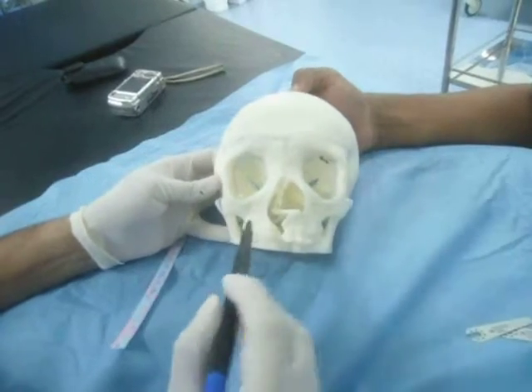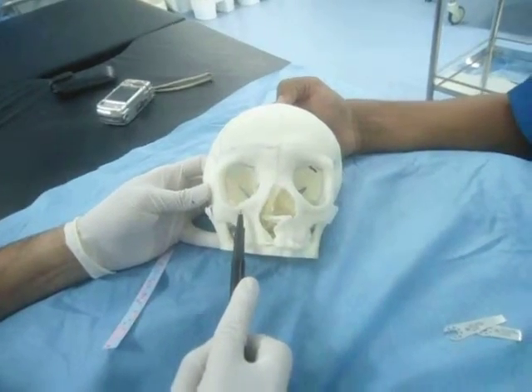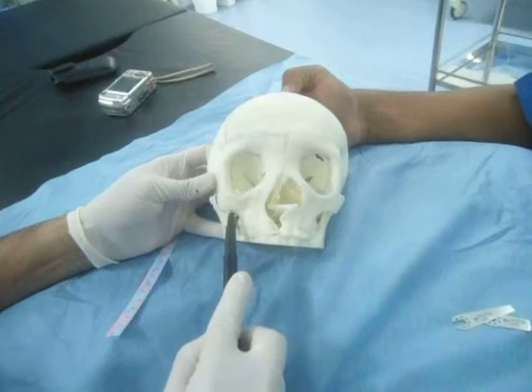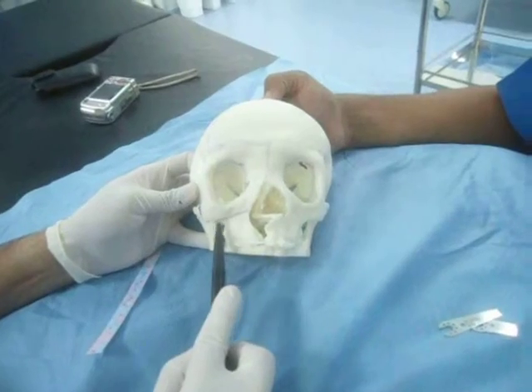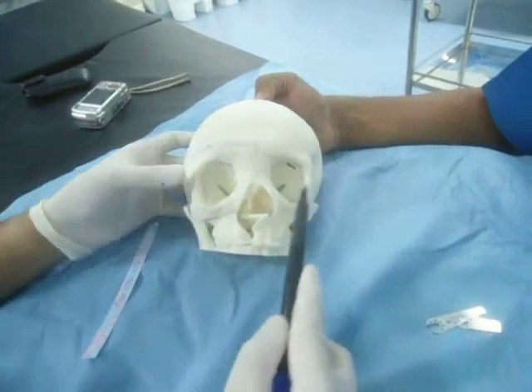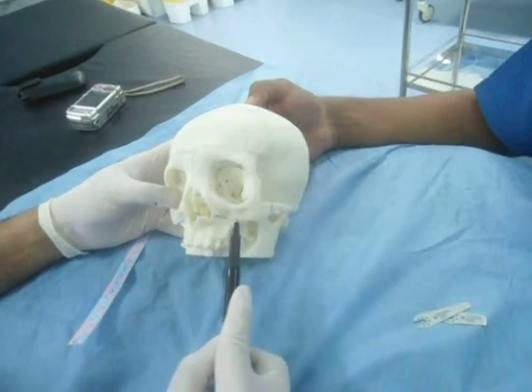Before we move on to the amount of resection, let's mark the inferior limit. So here we have the infraorbital foramen, and just below that we can make our inferior osteotomies of the box, which is here.